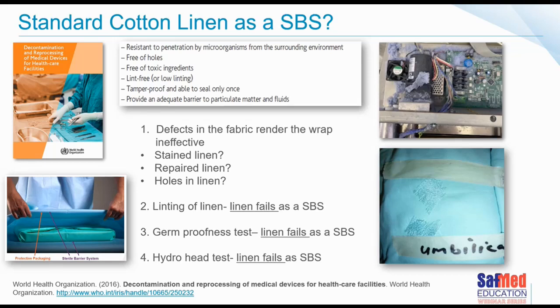Leslie, the wet laid is a method that's used in the web formation. I think maybe Roger may be able to give us a little bit more explanation, maybe a little later, Roger, if you would like to. Yeah, I'll just comment now, Leslie. It's wet laid.